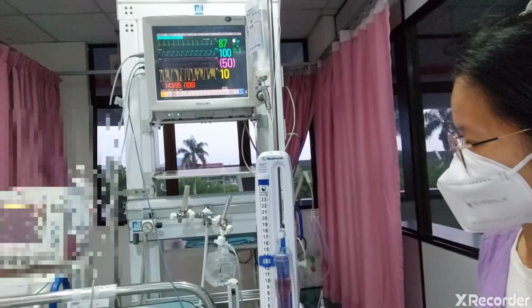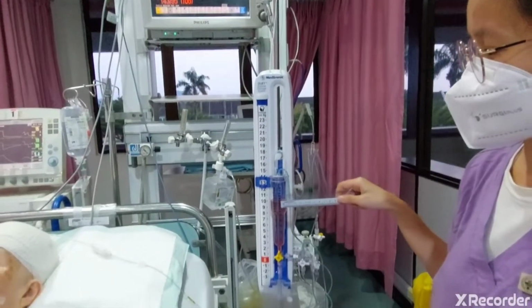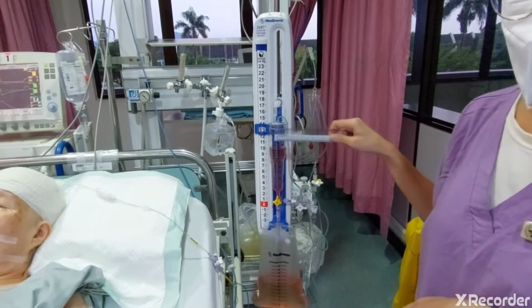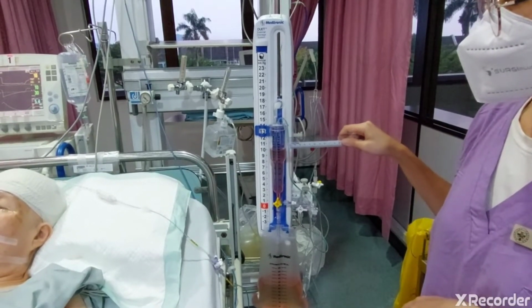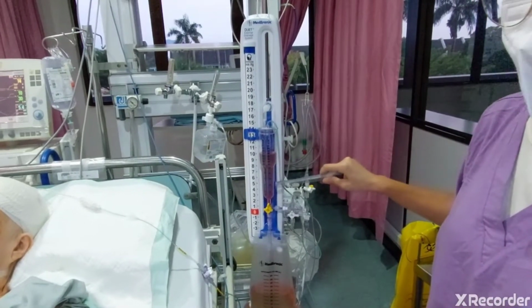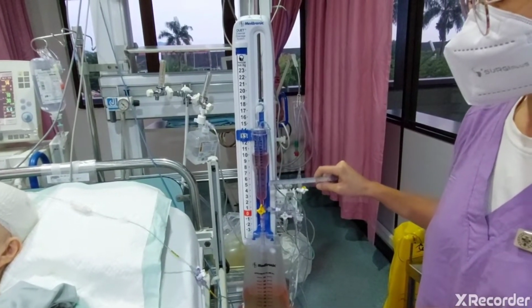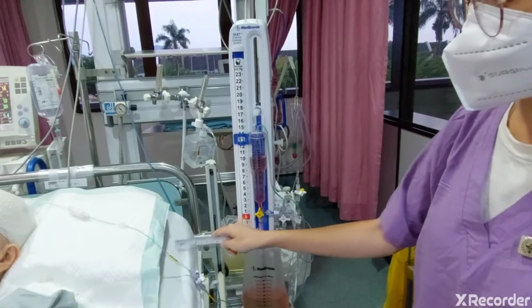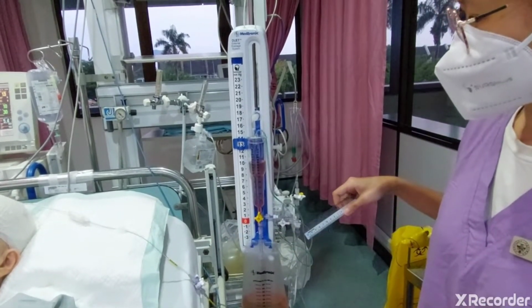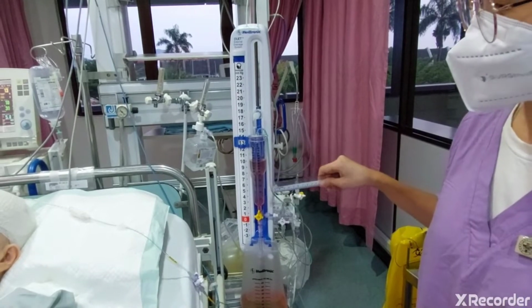The indication for this EVD system is to measure the ICP and to facilitate drainage of the CSF. This one is the CSF drain. Complications are infection or blockage of the intraventricular catheter, and excessive drainage, which can cause ventricular collapse.